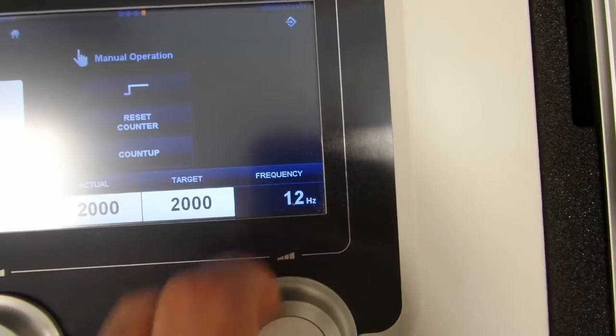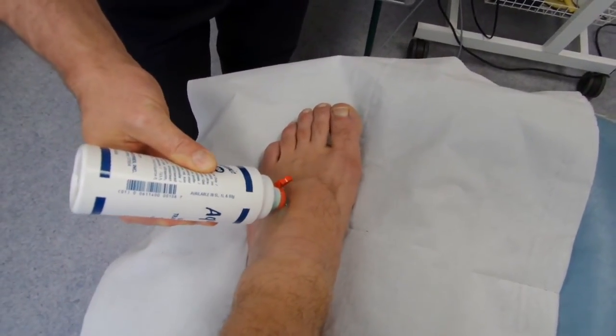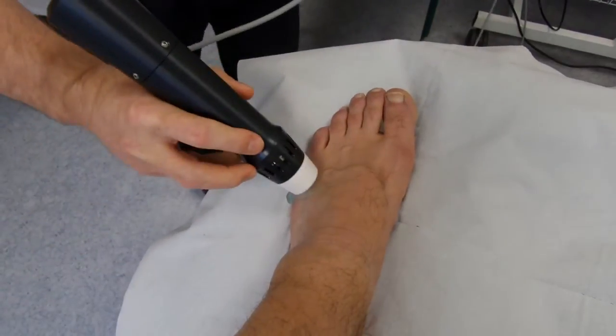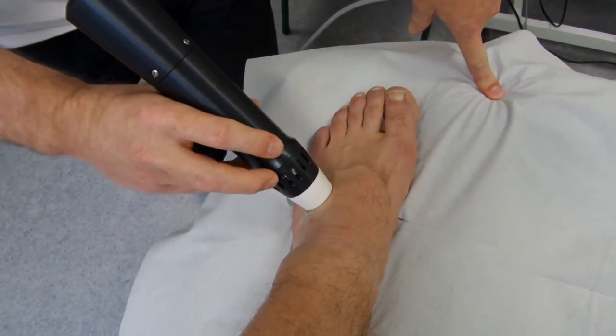The foot can be quite sensitive, so going up to 12 hertz can be quite a good idea. If you were to go down much, the pain would likely be much worse. If you were to go up much, the pain would be less but you would get much faster cavitation.